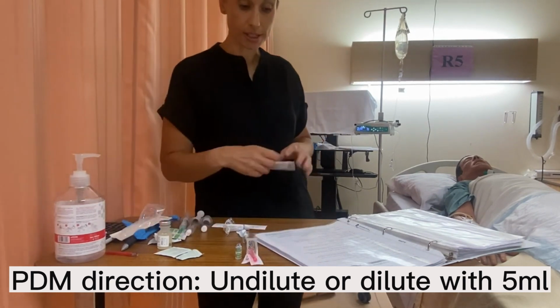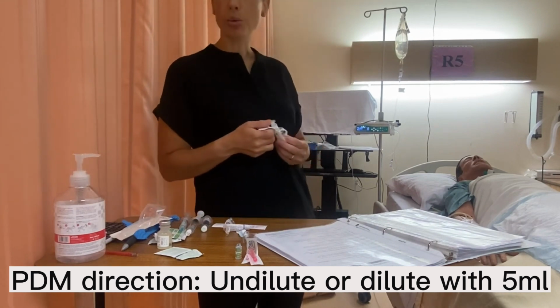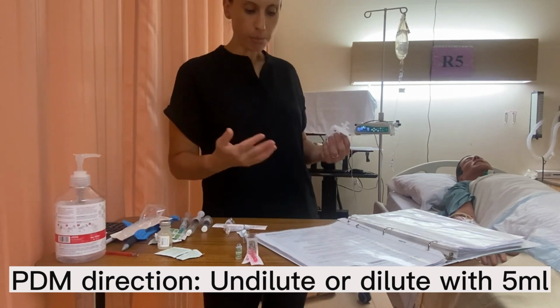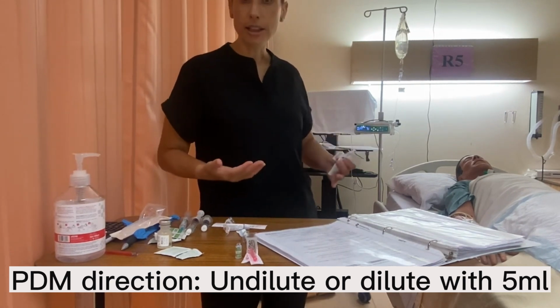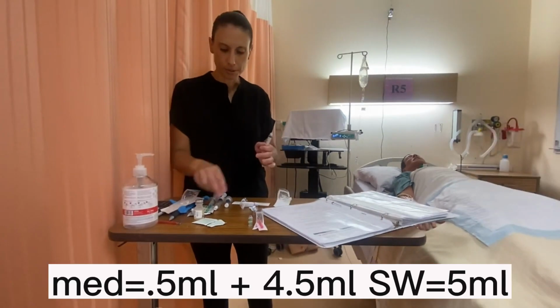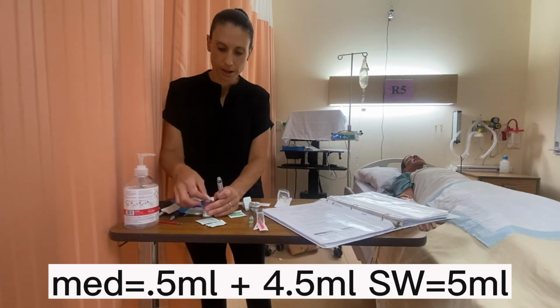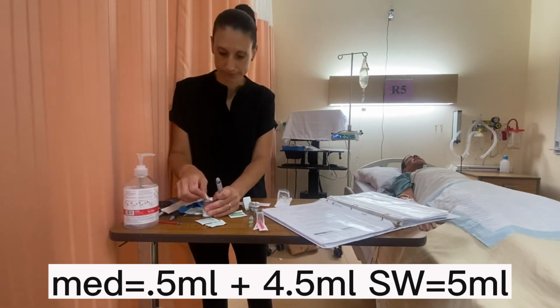What I'm going to do, because I like really easy math, is it said I can undilute or dilute with 5 mLs. So that means I can pick 5 mLs. I could pick slightly lower if I want. It's completely up to me. So I'm going to pick a 5 ml syringe, and I'm going to pull up 4.5 mLs of sterile water.